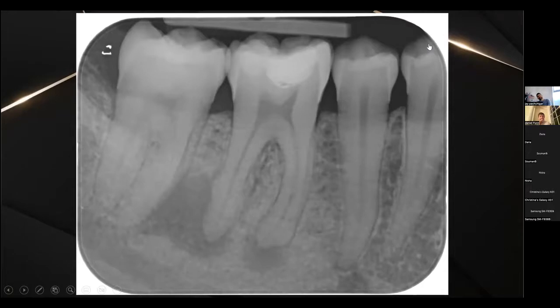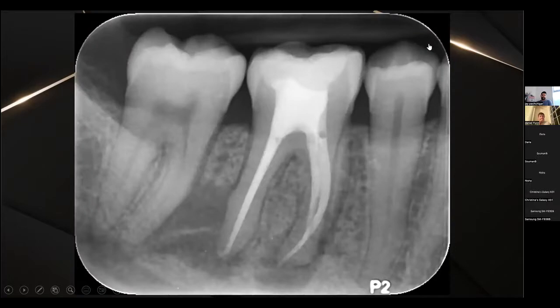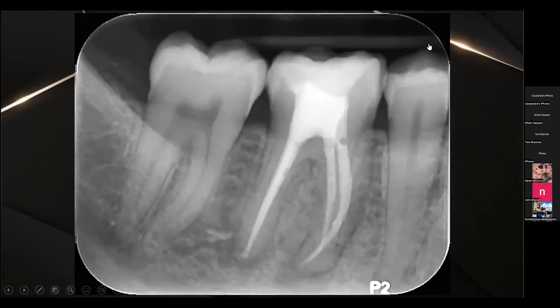Again, just another case with quite a big distal lesion here. This is a case where not every single time will I go very conservative, very skinny. It really is case dependent. These canals were a bit wider, and I felt it was best to go with a constant 6% taper instead. Again with a bioceramic sealer at my 6 months, we've got good, not complete, but very good healing. So now I think I'd be happy for them to go for a crown on this one.